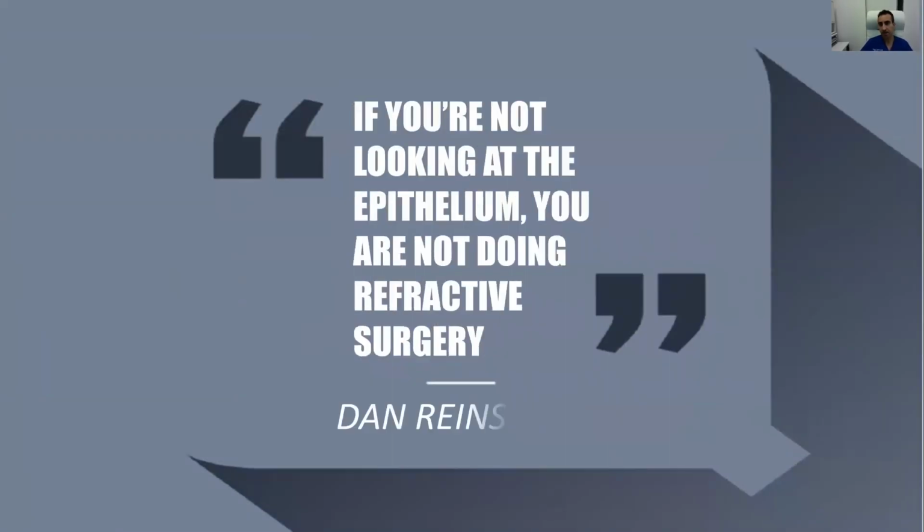But this tells us that if you're not looking at the epithelium, we're not doing refractive surgery, as Dan Reinstein has put it. And that's why looking at a tomography of the epithelium, along with other important measurements that the OCT tomography gives us, is vital as refractive surgeons.